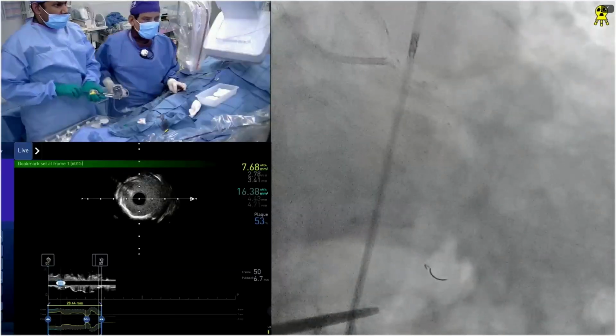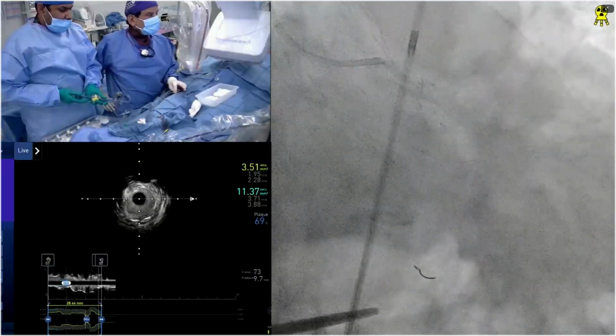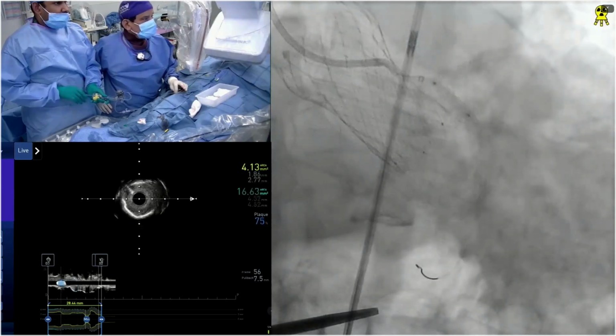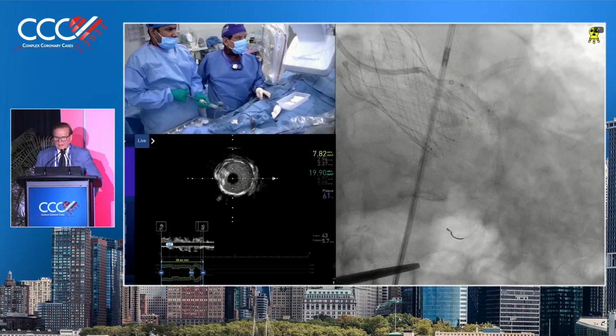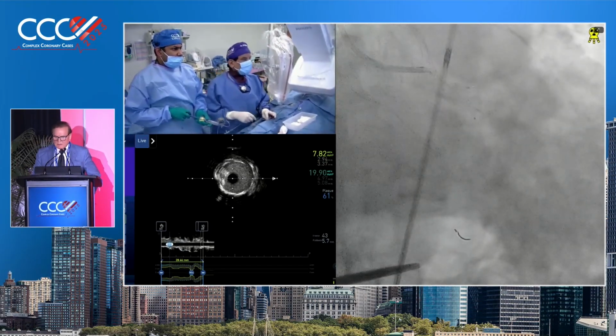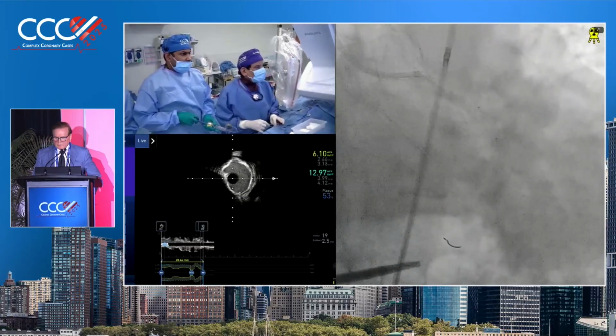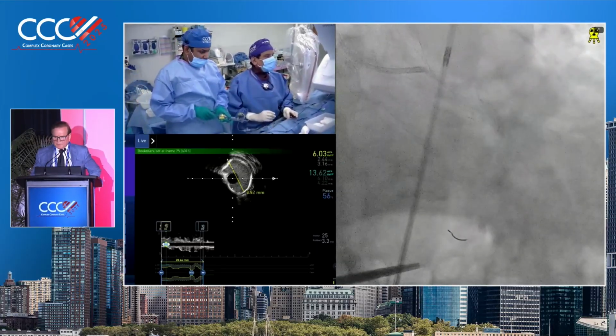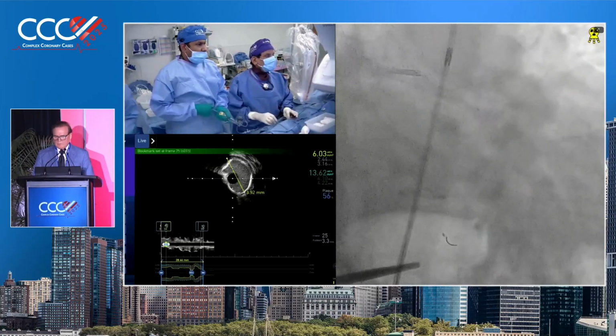Okay, go on. So it says you're precluded by the 8, the 10, by the 12 guide liner. You cannot use two wires or balloons. Yeah, not exactly. I took the wire out. I took the wire out. I mean, you can use it, but in this particular case, it will be a little tough. Correct. Because remember, the guide catheter is probably pinching on the guide liner.